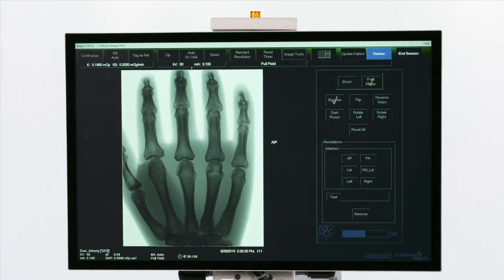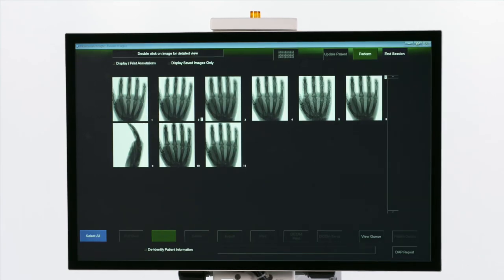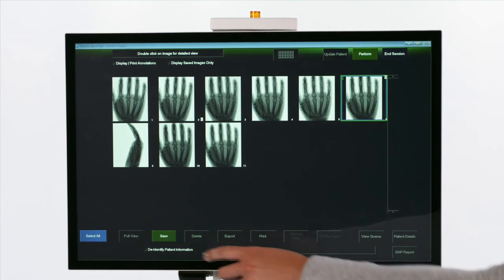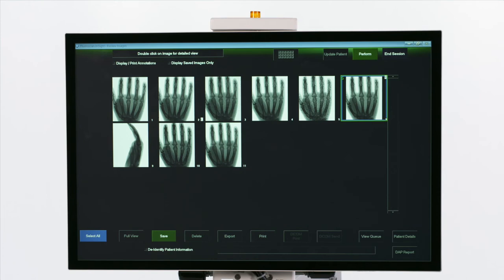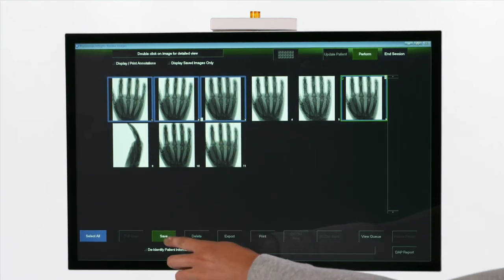Once finished taking images, click the Review button to review the images. All the images that were taken will now be here. To save images, click the image and hit the Save button. An S will appear in the corner of the image showing that it has been saved. By clicking Control on the keyboard, multiple images can be selected and saved at once.